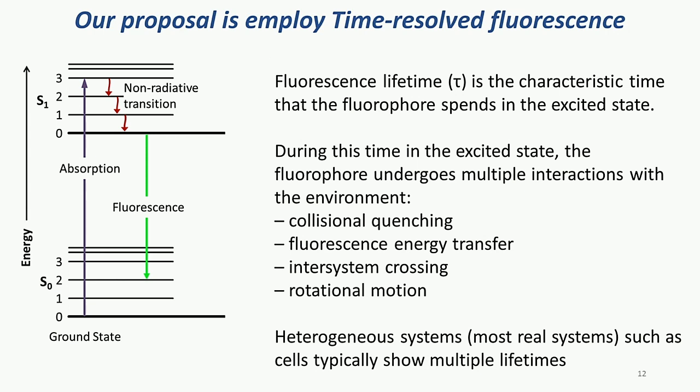That means for specific fluorophores, when you excite the molecule, the lifetime is the time that the molecule spends in the excited level before emitting the fluorescence. The excited state is unstable, so the fluorescence transition occurs faster or slower depending on two parameters: the molecule's electronic structure, but also the environment. If you have a different environment, you have different lifetime values.